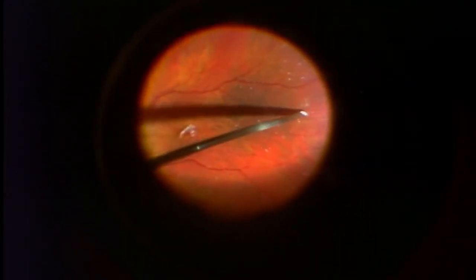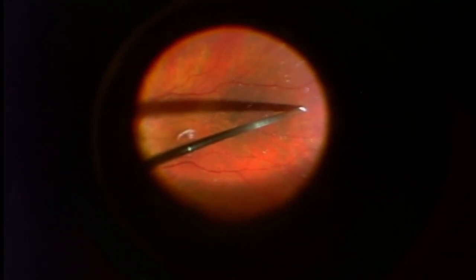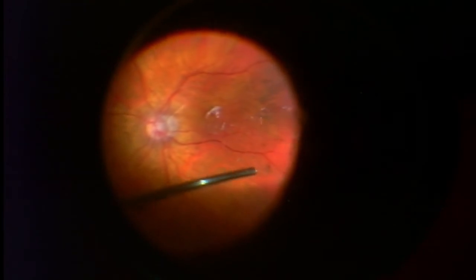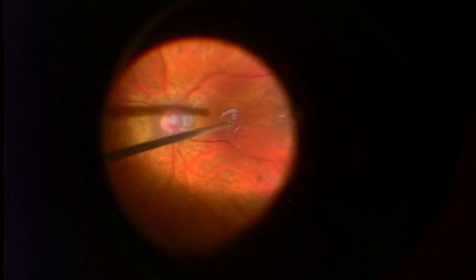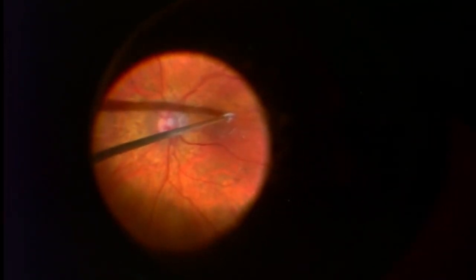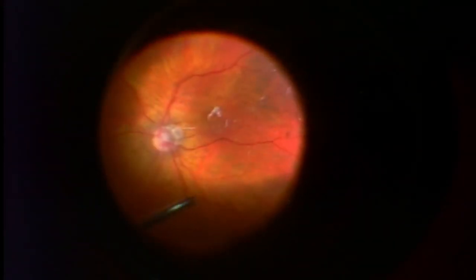Now there's some haziness in the front of the eye. This patient had a lot of oil in their tears, so it was very sticky on the surface of the cornea — we had to wash it off more frequently than we normally do to keep the cornea nice and clear. There's a little bit of Kenalog stuck on the macula, but I decided to just leave it there because it'll dissolve by the morning.